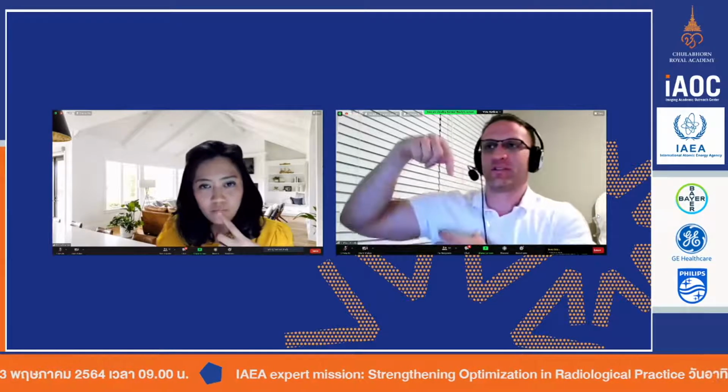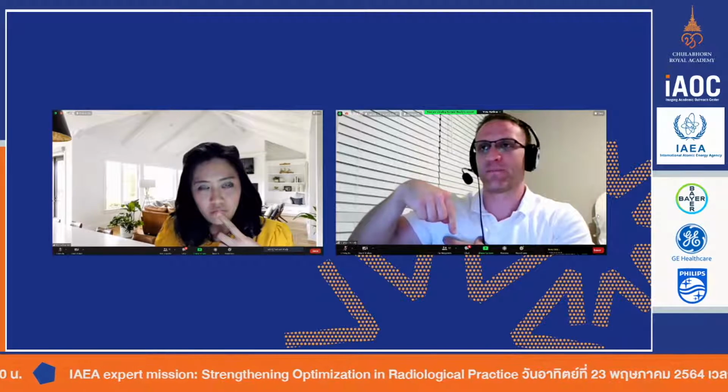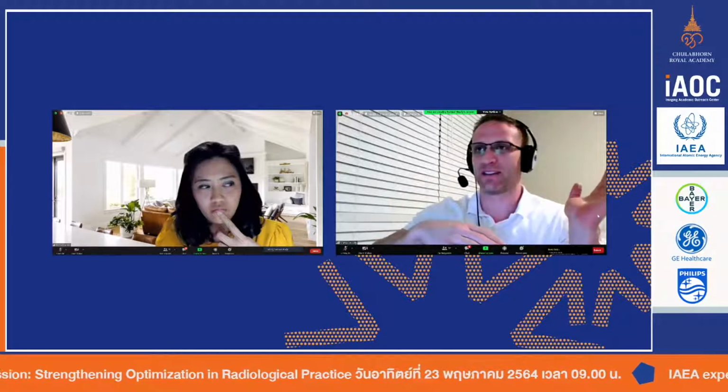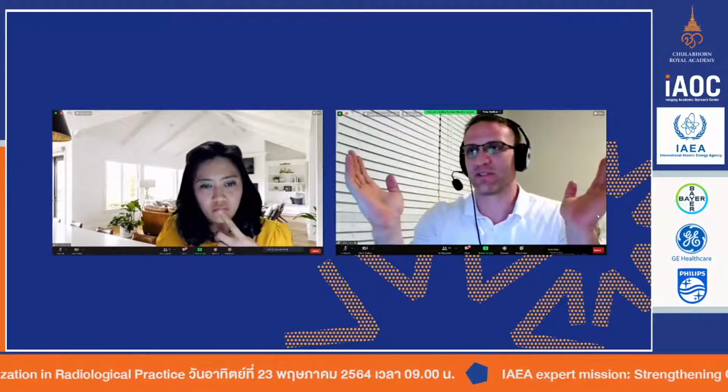So 2, 4 for full field digital mammography, 6, 8 for full field digital mammography, and then if you do 1 tomo sweep for the left, 9, 10, 1 sweep for maybe the right, 11, 12. So that's probably standard right there. Sometimes you might do a sweep on the MLO, but at least here in the US, that's typical. You'll get 2 shots plus the sweep.